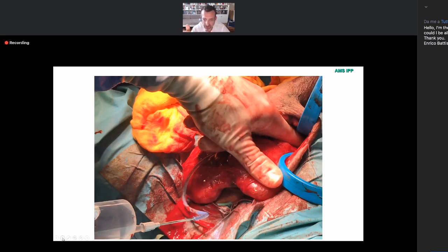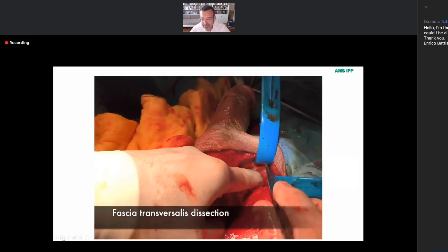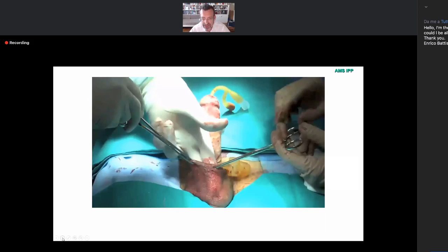Next slide, please, Russell. At this time, you only have to fill with, usually, if you use the concealed reservoir, it's enough with 65 cc's. For all the cylinders below 20 centimeters, 21 centimeters, 65 cc's is enough. And finally, you can make a pocket in the scrotum.